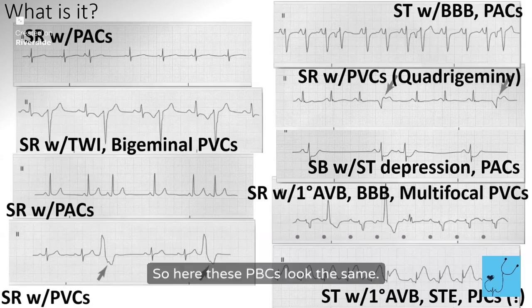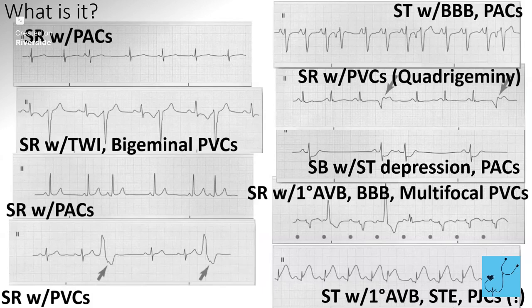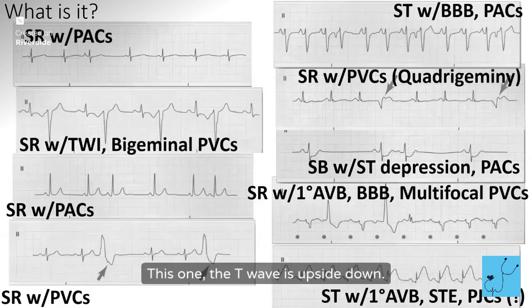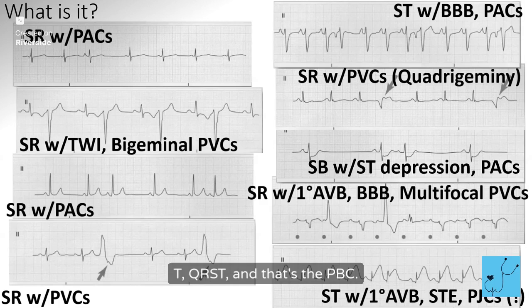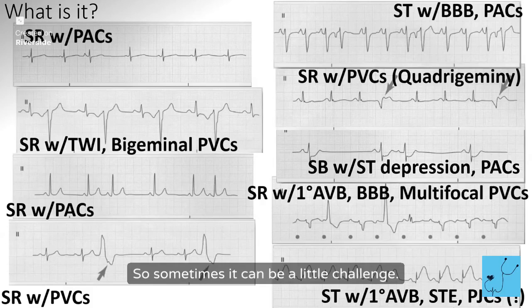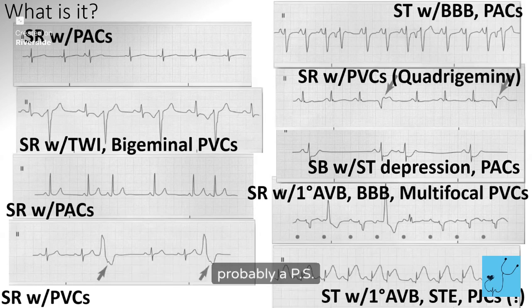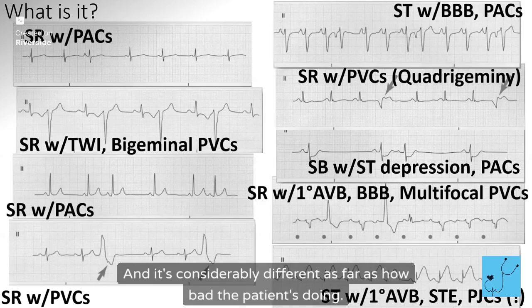So here these PVCs look the same. PACs, they look exactly like their buddy, right? This one, the T wave is upside down, PQRST, and that's the PVC. So sometimes it can be a little challenging. But yeah, if you're thinking, oh, it's a PVC, but then it looks like the other one, it's probably a PAC. And it's considerably different as far as how bad the patient's doing.